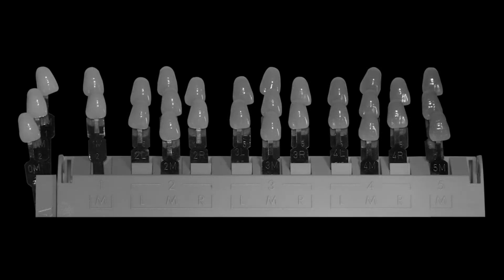Now if you reference back to the 3D shade guide, the 3D shade guide actually is oriented by value. So what I mean by that is if you look at that bleach shade guide that I referenced on the far left side, the bleach shade guide is an OM shade, or OM1, OM2, OM3. All of those shade guides are the same amount of gray. You cannot tell the difference between them.